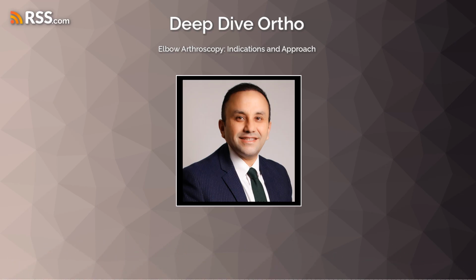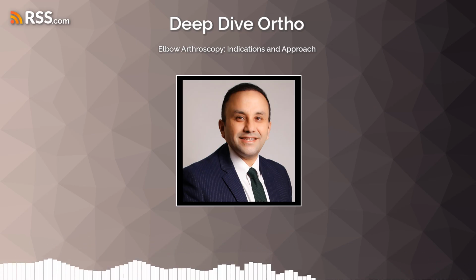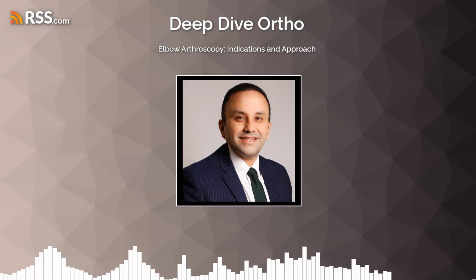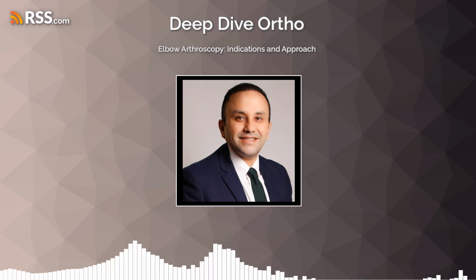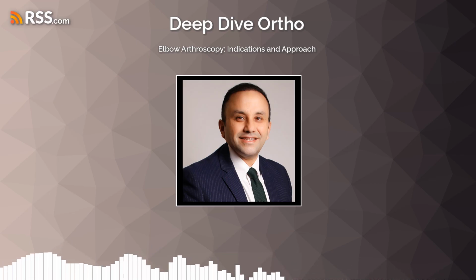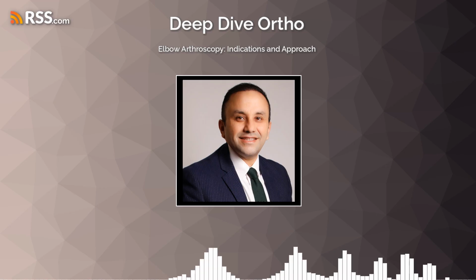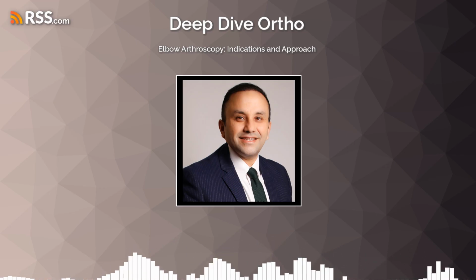The knock-on effects. Yes, such as arthroscopic removal of posteromedial olecranon osteophytes, which offers less morbidity than open surgery, and the removal of loose bodies. It's important to note that patients with valgus extension overload should be thoroughly evaluated for UCL insufficiency, as some studies suggest that debridement alone, without addressing underlying instability, can lead to ongoing instability requiring reconstruction. So arthroscopy is more about addressing the consequences of the instability rather than directly repairing the main ligament for valgus instability. That's a key distinction.